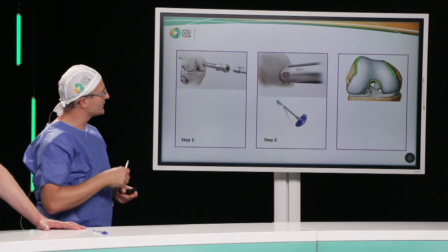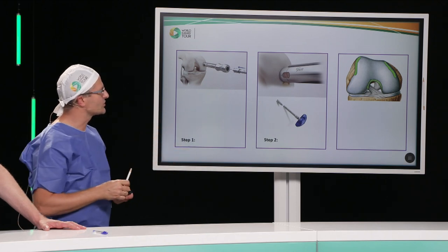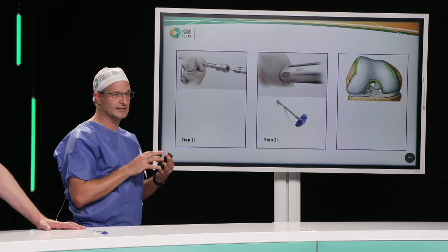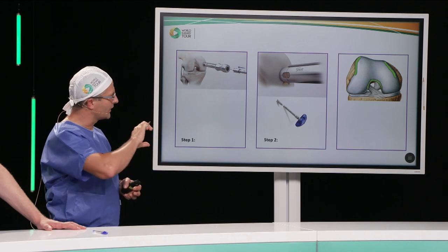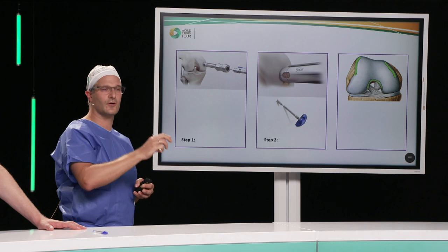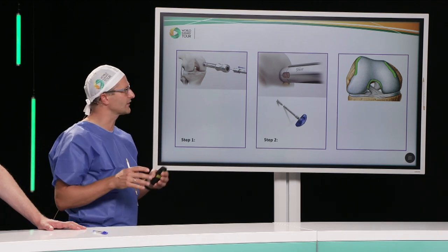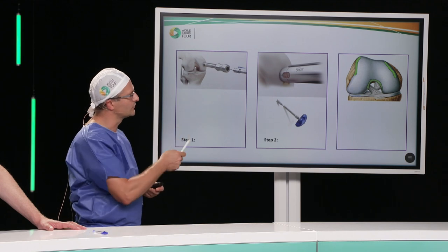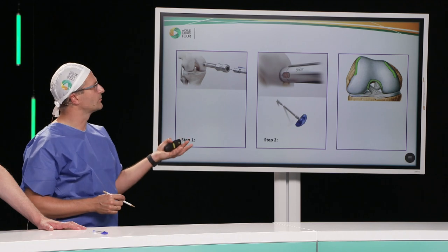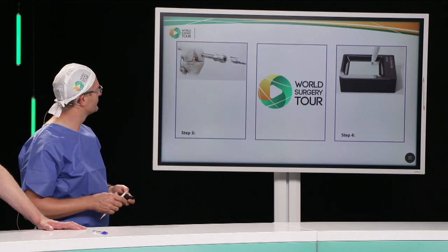You see that little wire that's stabilized, then you have a little window, as you can see on the step two picture, which allows you to control that the placement of this cannula is ideal. And then you have a reamer that allows you now to harvest the cartilage from the defect size. If in case you cannot obtain enough cartilage tissue, you have also the option to go to areas where you typically, for example, would harvest cells for an ACI to have more cartilage that you can use in this one-step procedure to apply to the defect.